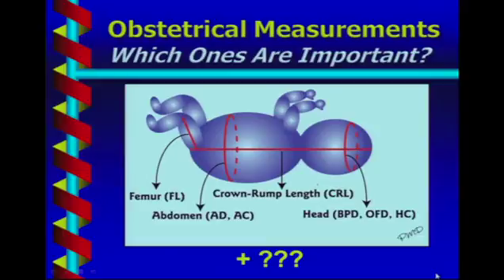But one of the other elements that I'll be focusing on is, of the various other measurements that one could measure, which ones are important to measure, especially on a routine obstetrical ultrasound.